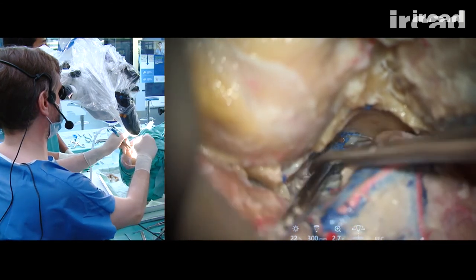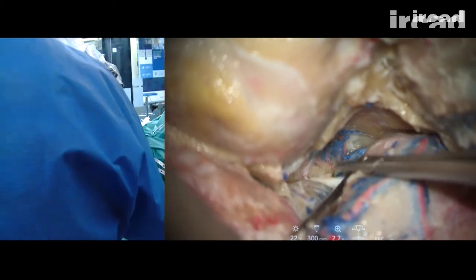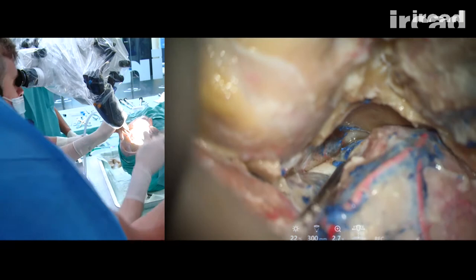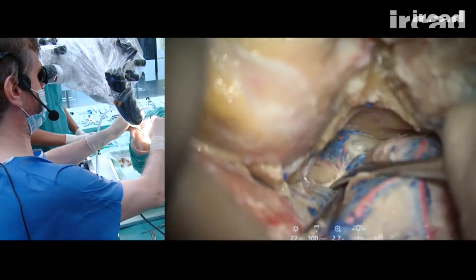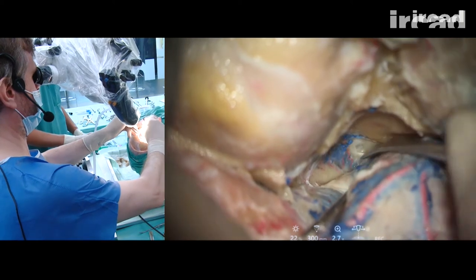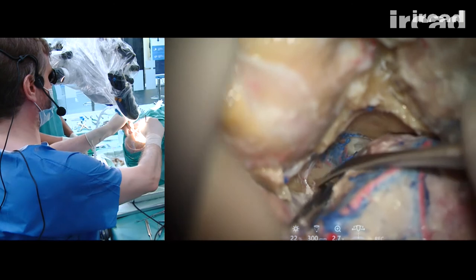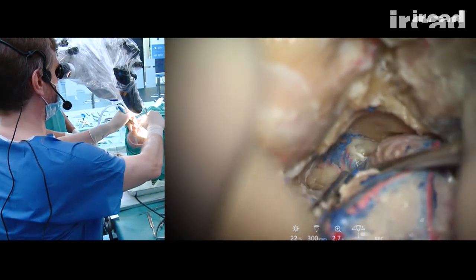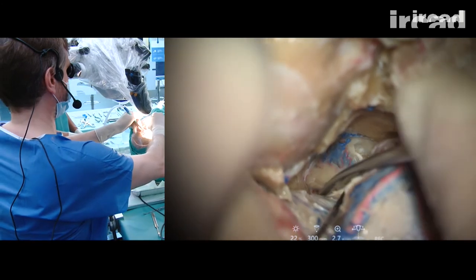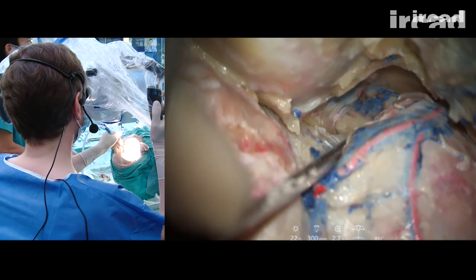So this is the cleavage plane between the dura and the inner layer of the cavernous sinus. So if I am dealing here with a cavernous sinus meningioma, for example, doing this, I separate the cavernous sinus part of the meningioma from the intradural part of the meningioma.